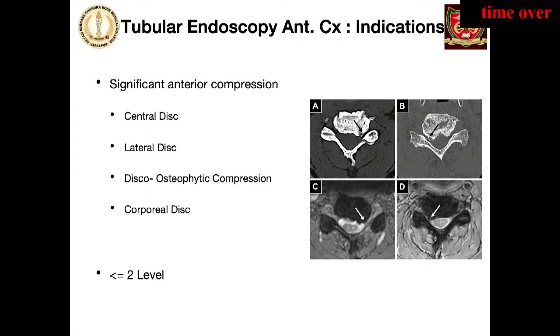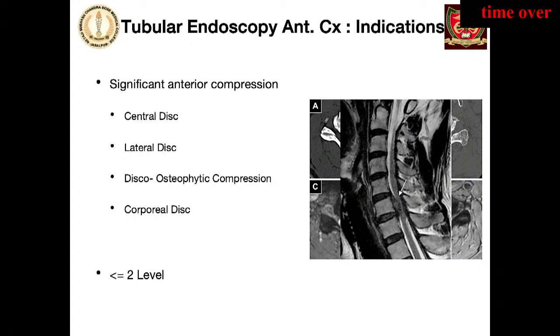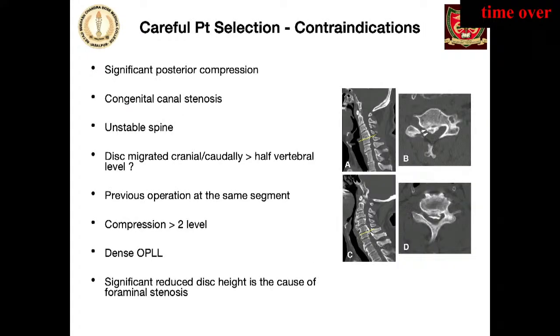The same tube has been used for the anterior cervical discectomy for disc preserving approach, in which cases the fusion is not required. You preserve most of the disc, and the motion segment has also been preserved. So there are indications for anterior disc preserving surgery: disco-osteophytic compression and soft disc like this.